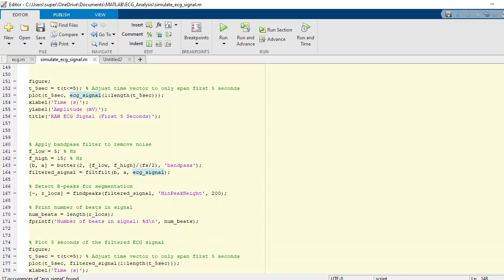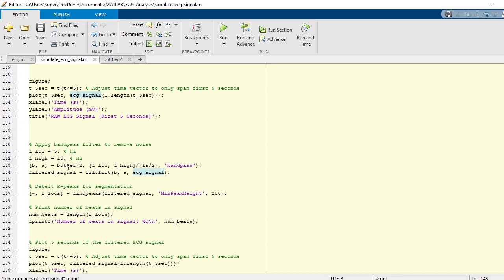The lower frequency which we need to bypass is 5 Hertz and the maximum we require is 15 Hertz. That's the basic range of the ECG signals. We apply a Butterworth filter on that, so we need to find out the coefficients of B and A using a built-in MATLAB function which is part of the Butterworth filter.